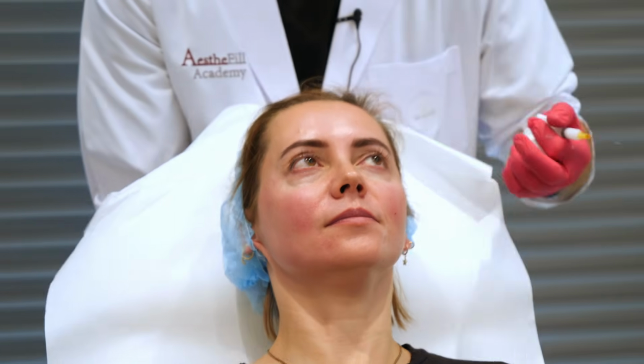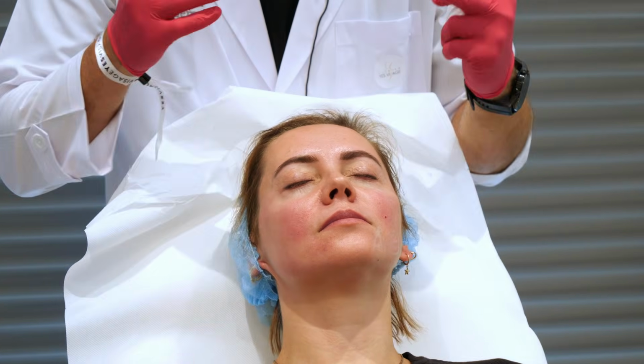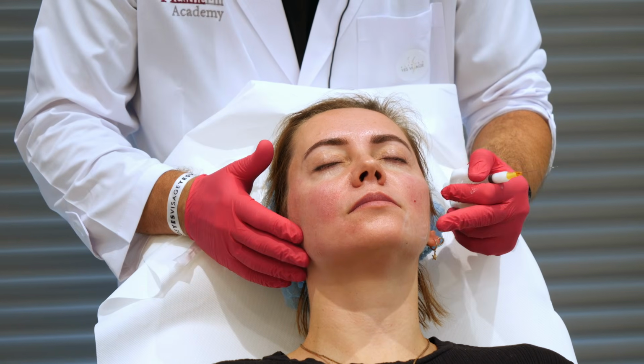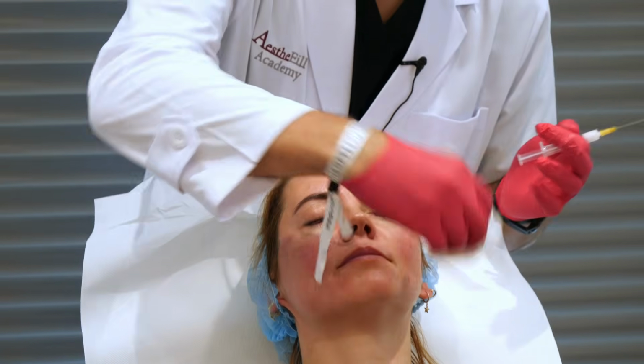At this moment, I prefer to see the patient from this plane, because the negative vector you can see better from here, okay? And I try to find the correct symmetry between the two hemifaces, okay? It's better. It's okay for me. Go up again.